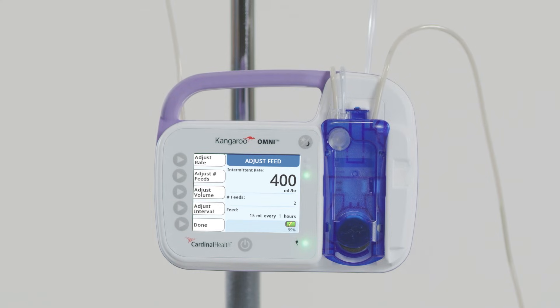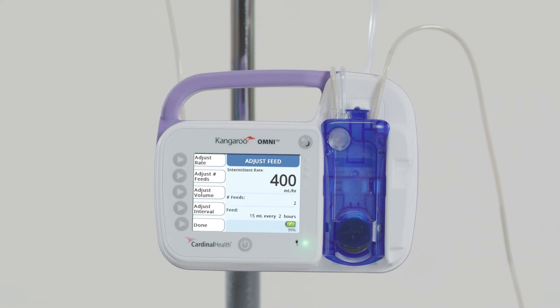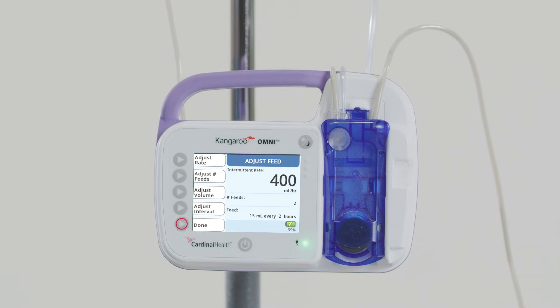If the selected number of feeds is greater than 1, an Adjust Interval button will appear to determine how many hours between feeds. Press Adjust Interval and use the plus and minus buttons to set the interval between feeds in hours, then press OK. Press Adjust Volume and use the plus and minus buttons to set the volume of feed to be delivered, then press OK. Press Done to go back to the Ready to Feed screen.